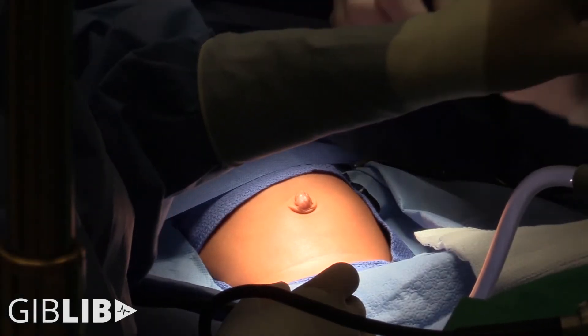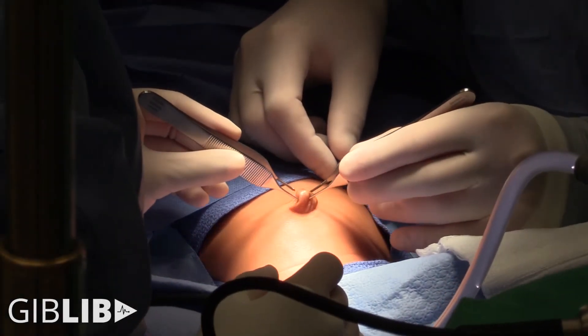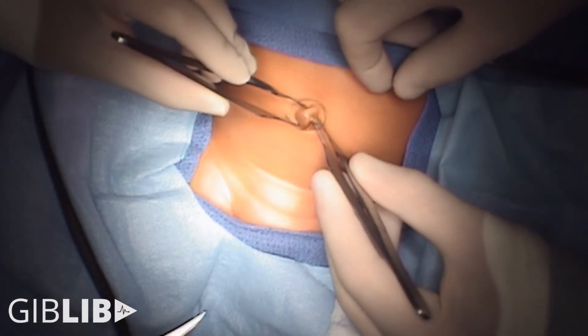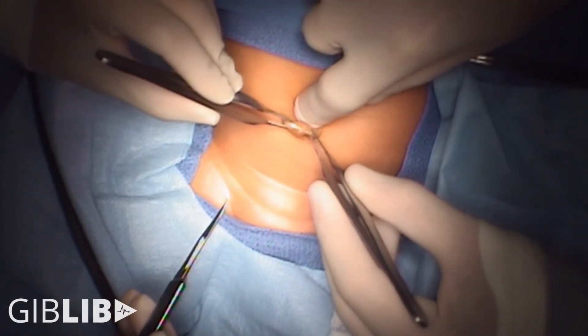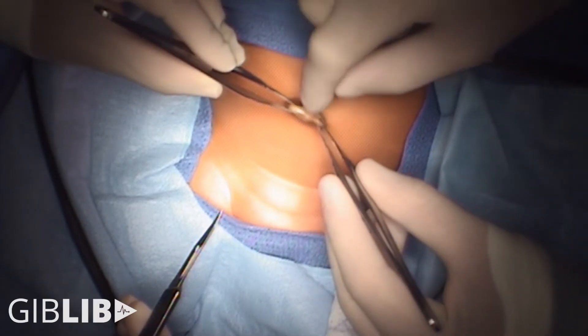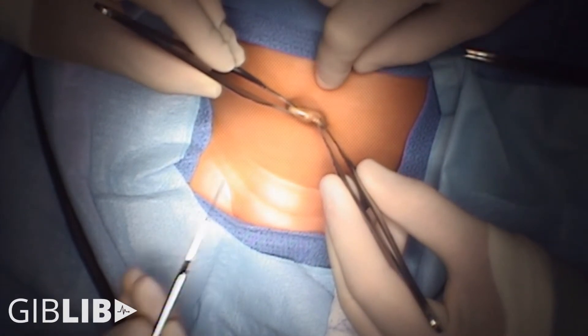We have a couple of Adsons, 11 blade to Michaela — we're going to start. I like to do this vertically; we sometimes have to make it a little bigger at the end. She's got a pre-existing umbilical hernia, so at the end we might have to extend the incision just a little to be able to fully address that.